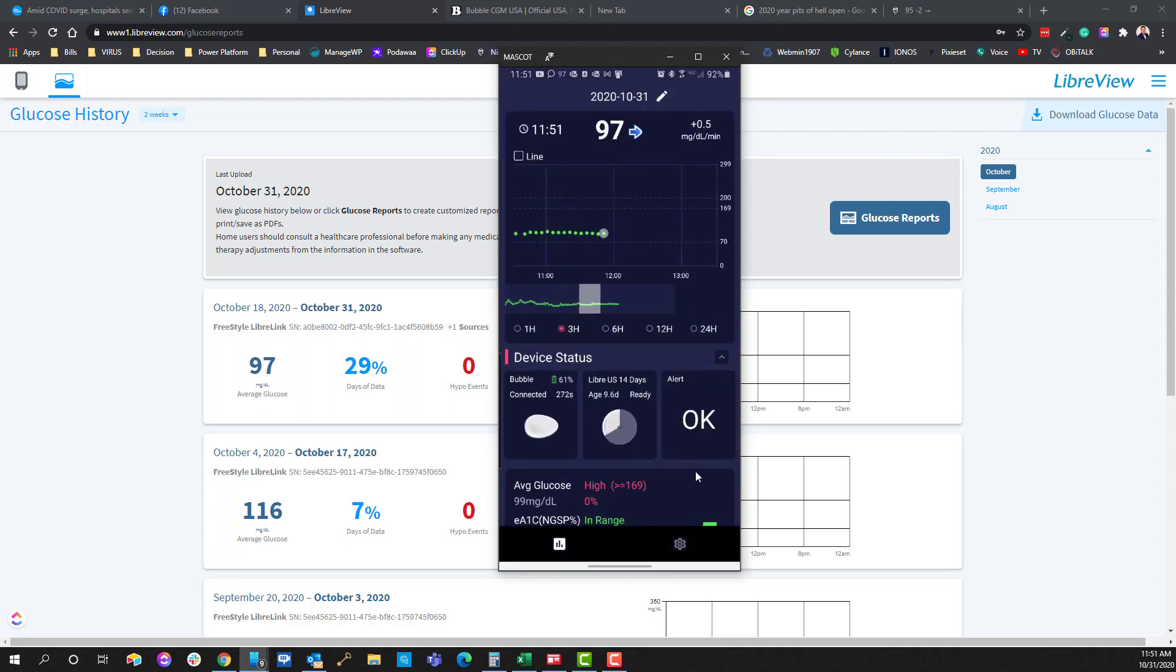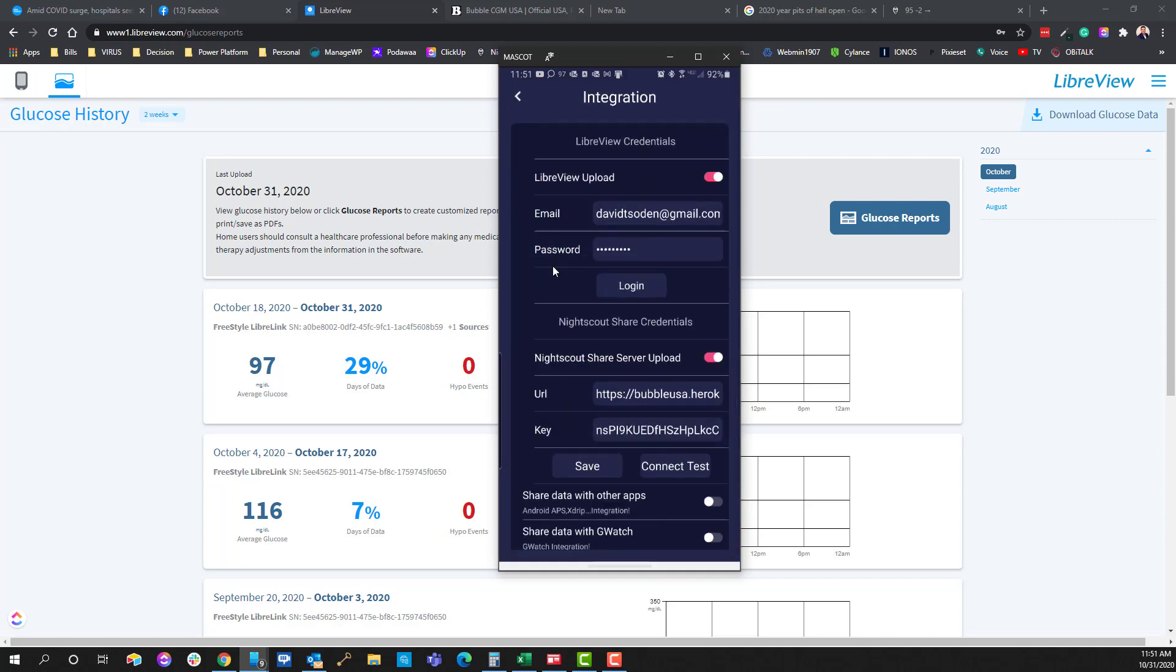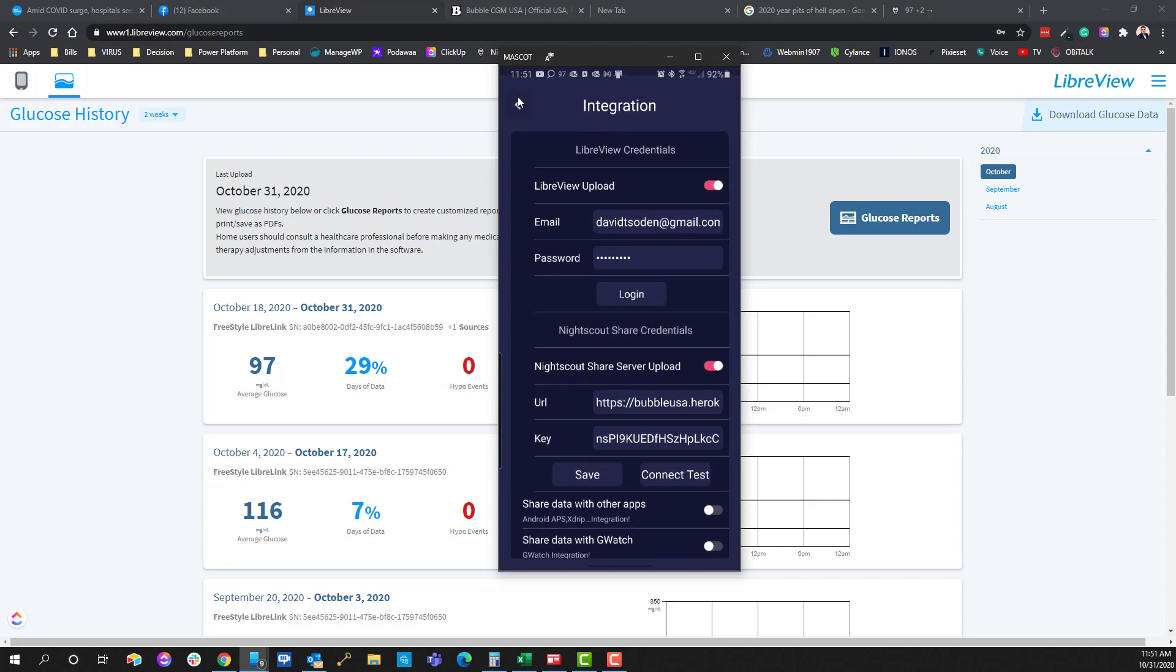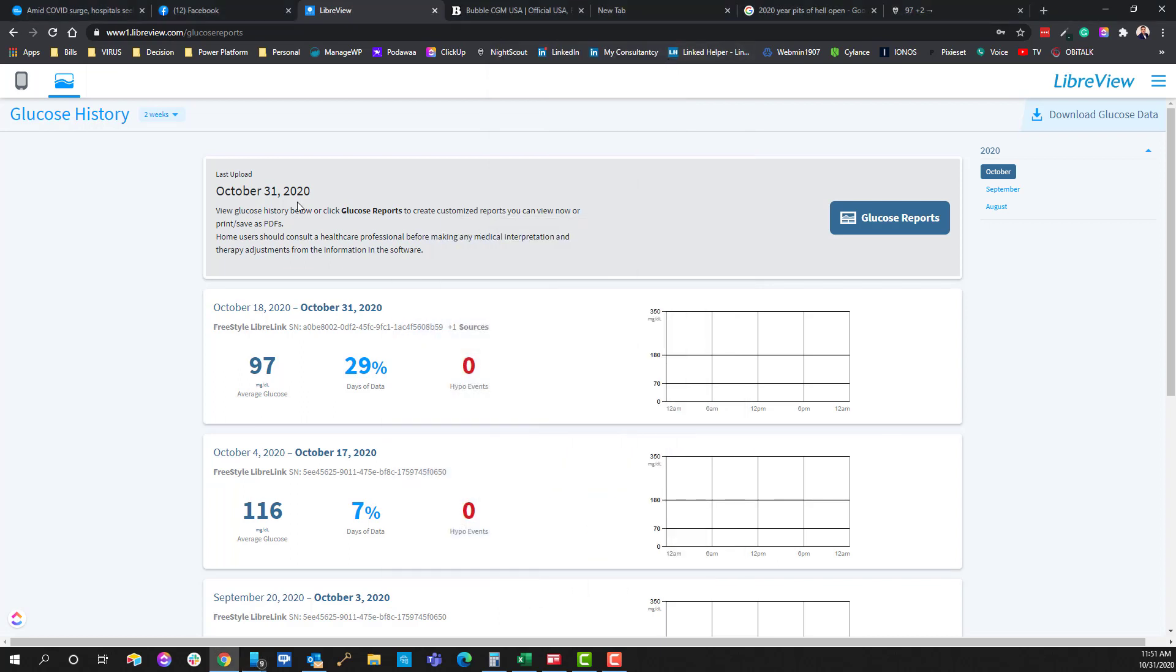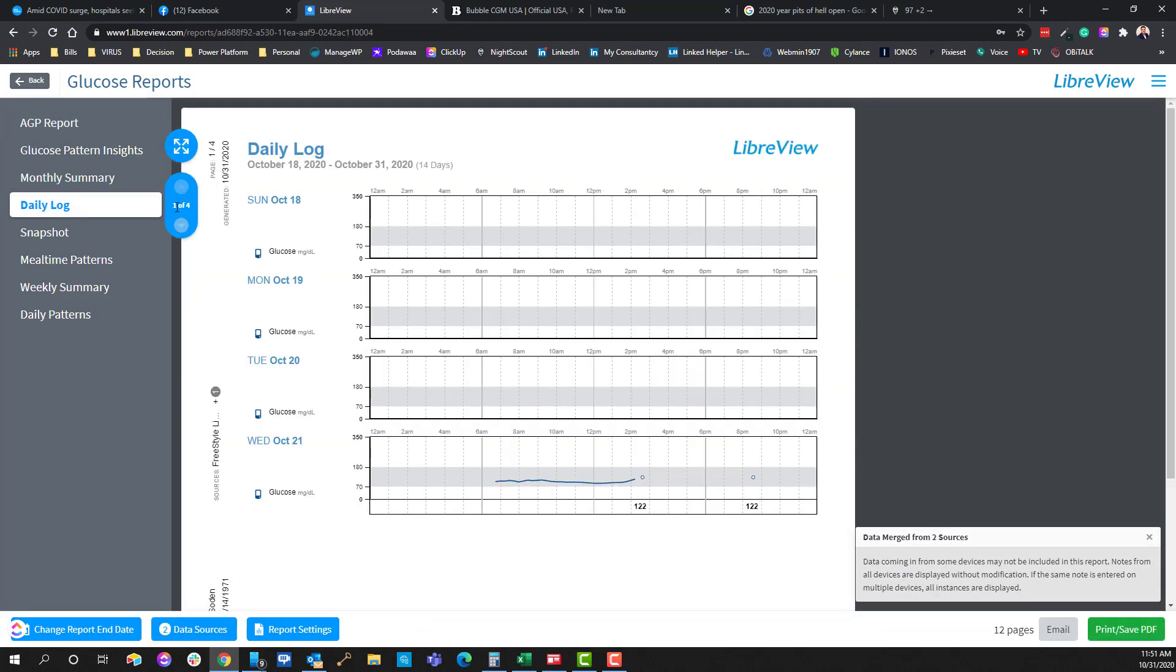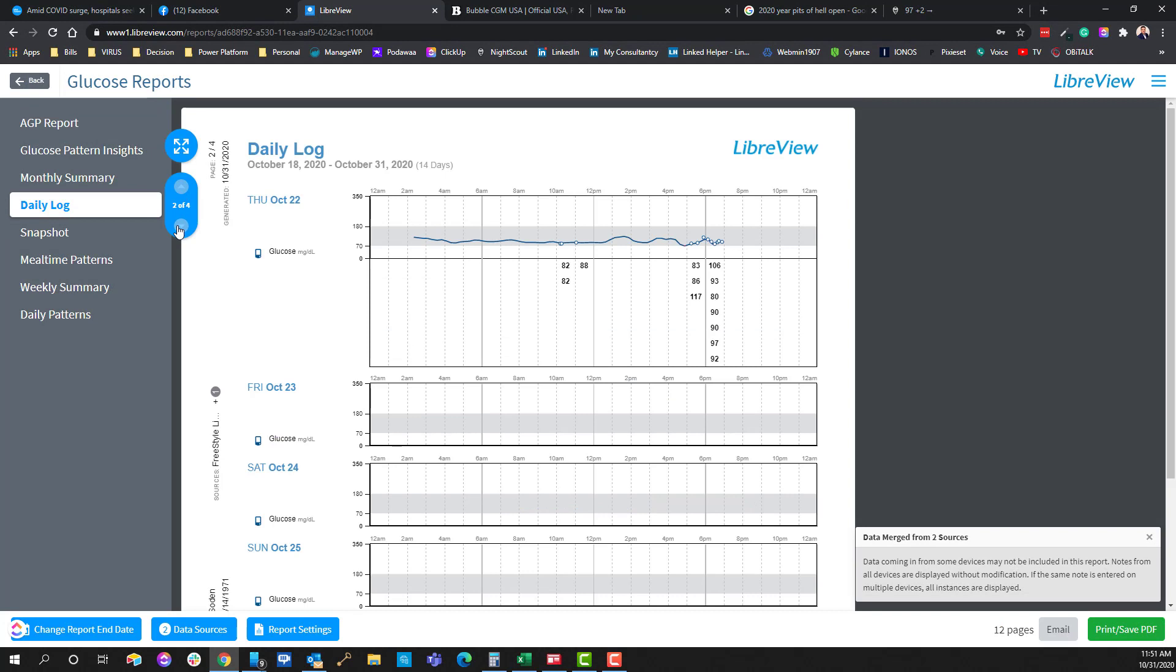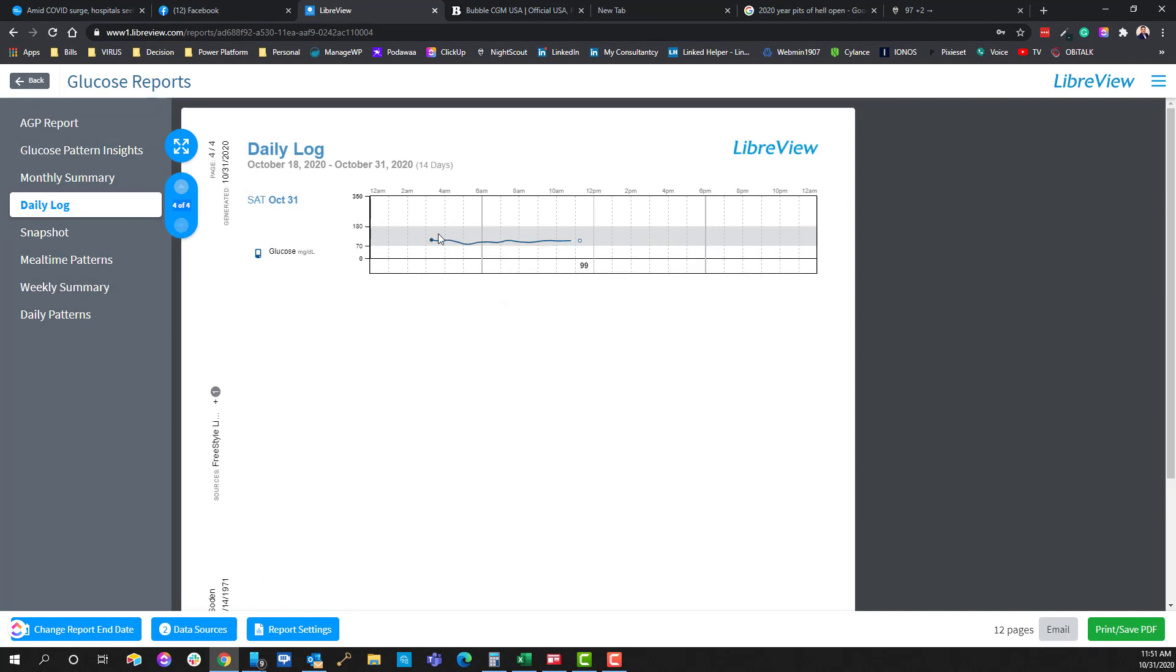So back over here again under settings, under integration, after you've gone ahead and connected this, the information will be updated every 15 minutes into the LibreView portal. And if you go down here, you can go into glucose reports and we can go to daily log and then I'll page down to today's date and you'll see that I've got all of the data now as of this morning going back eight hours. And so you can see that this is now connected.